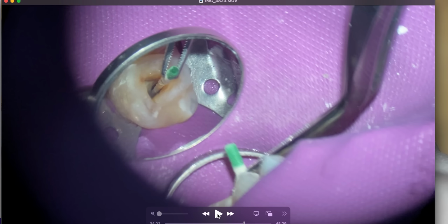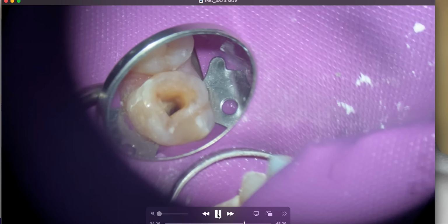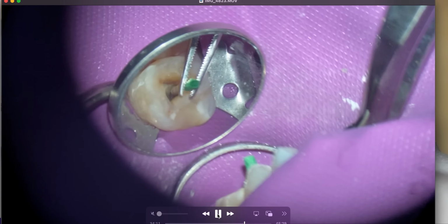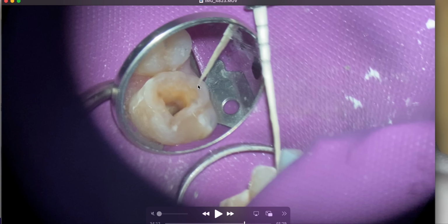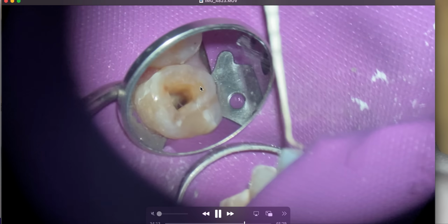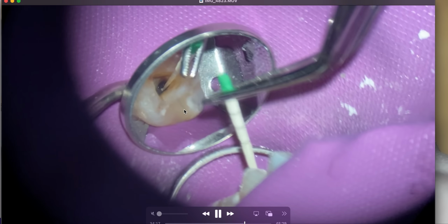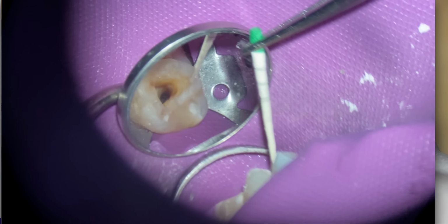And then I was like, you know what? Let's take a look here. I started drying because I didn't see anything. There was no change. I'm like, okay, well, nothing's going on. And then when I started taking my paper points, the paper points got really wet. Right there, you can't see very much, but this is all really wet. And then we had some liquid starting to fill the canal. And my mind went, there you go. You see how wet that is?